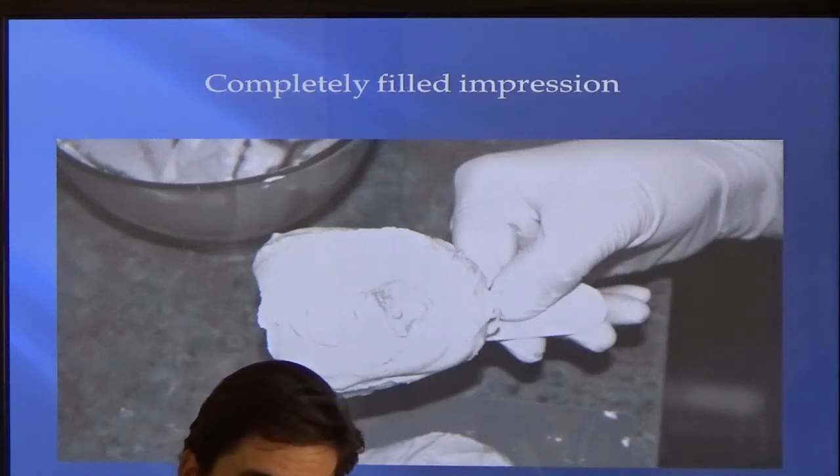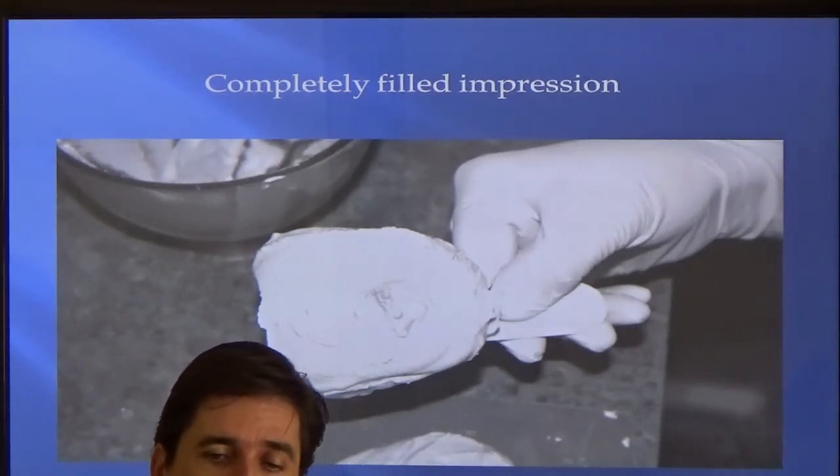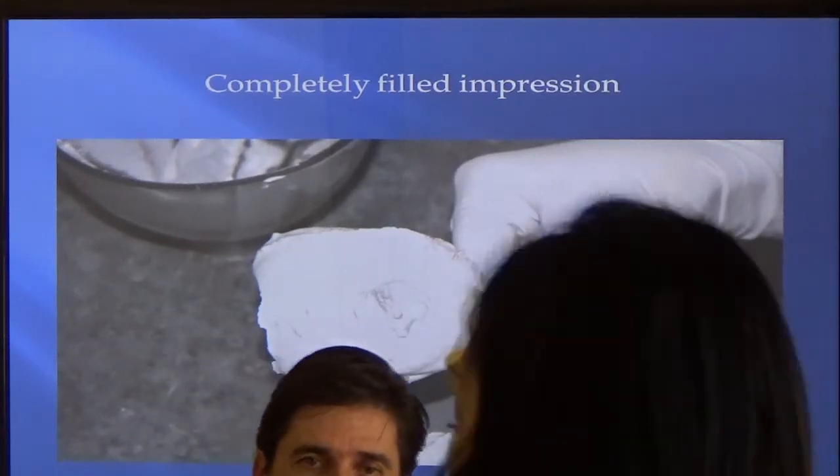All right. So we'll take the quiz real quick, and then we'll take impressions. We'll pour up the models. Take bite registrations. That should be it. It's a fun lab, and you guys are going to get all messy.